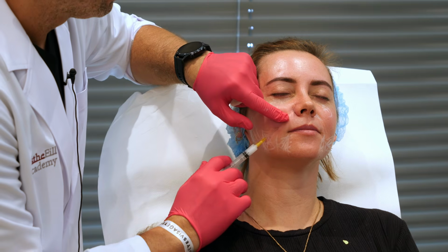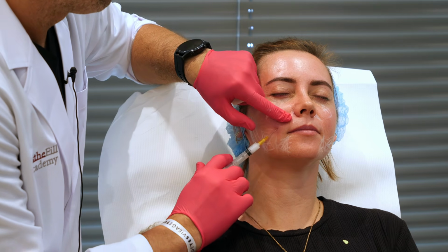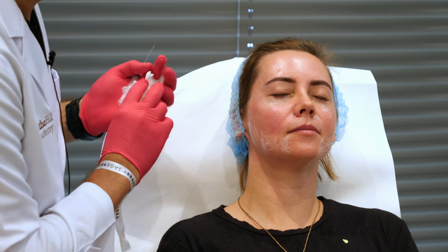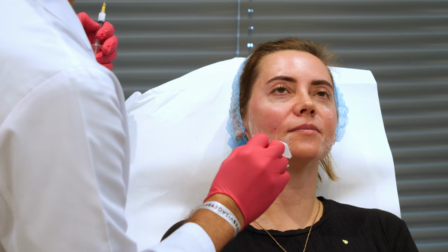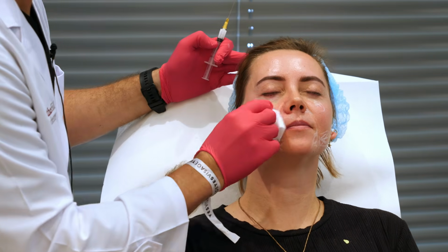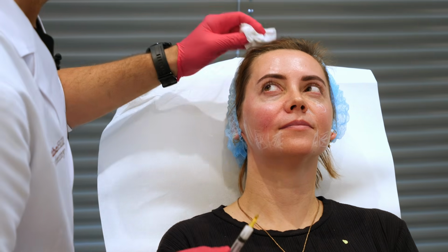It's a very deep piriform fossa, and I put about 0.3. 0.2, 0.3. Okay.